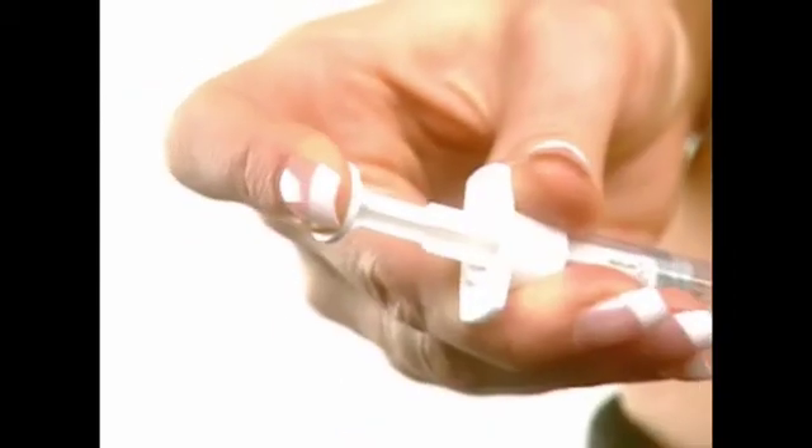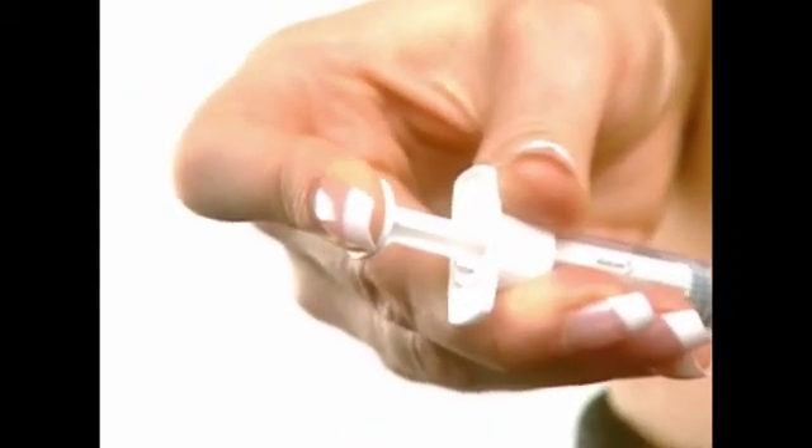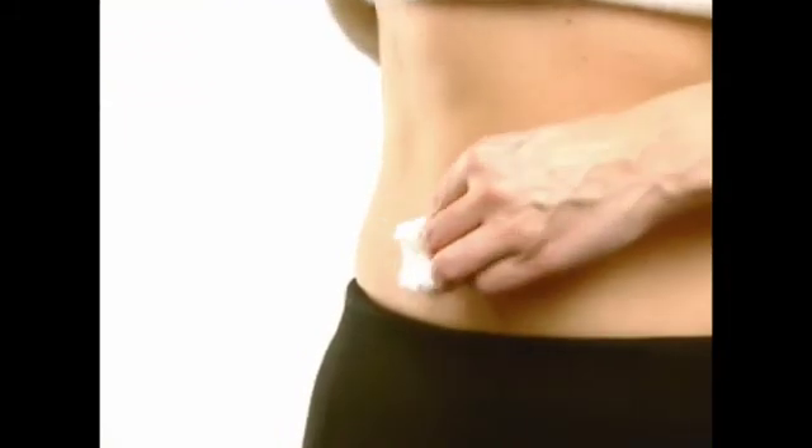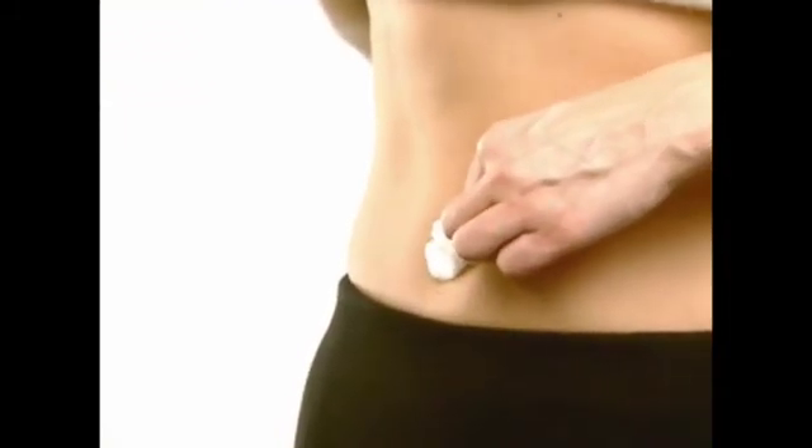Release the hand pinching the skin and depress the plunger in a slow steady motion until all the medication is injected. Gently withdraw the needle and apply pressure to the injection site using the gauze pad. Discard the empty syringe in your safety container.